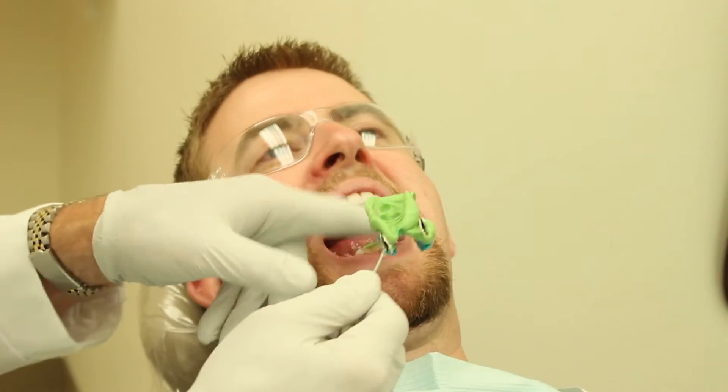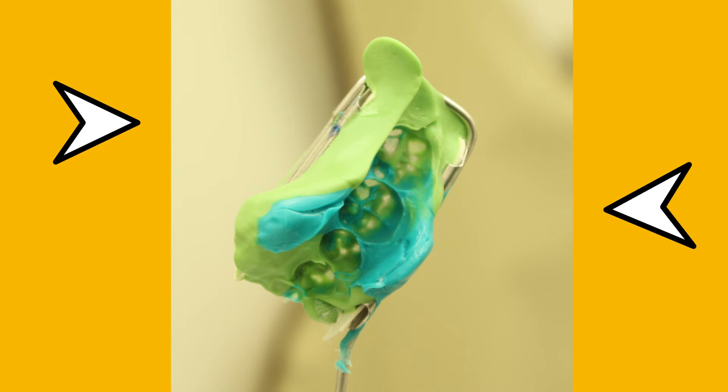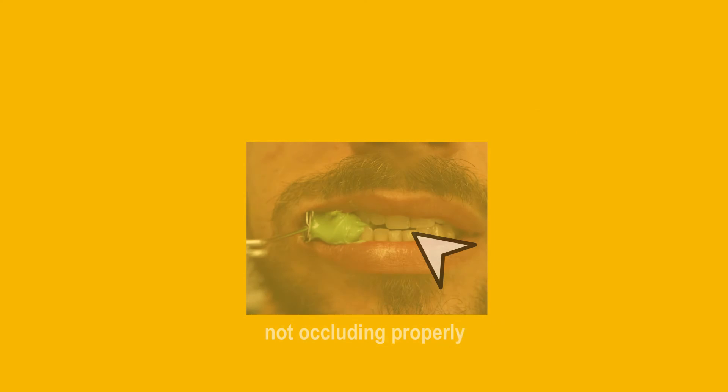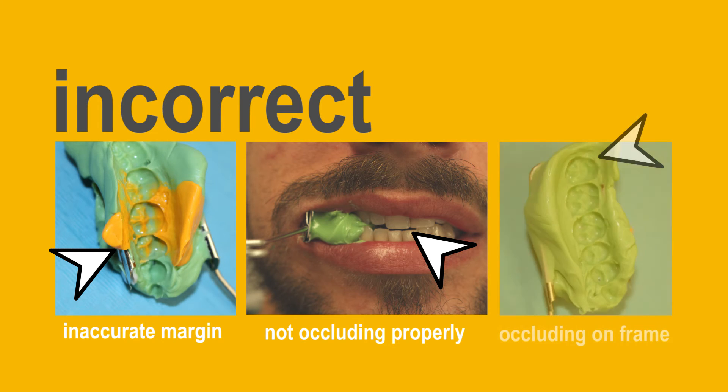Once the material is set, you remove it and hold it up to the light. If the patient was occluding normally, you should be able to see light where the material is thin. If not, they may not have closed properly. There shouldn't be any rub areas on the side, and they shouldn't have bitten into the frame. And hopefully you didn't put the handle on the wrong side, or they won't be able to close at all — then you're in trouble.